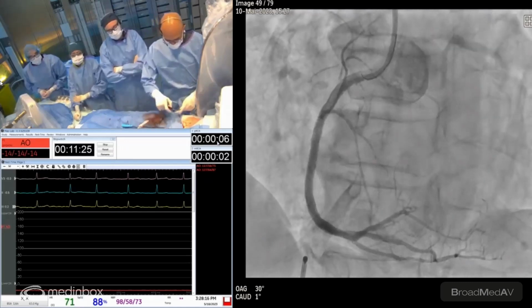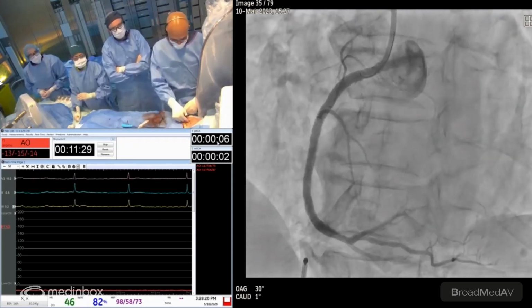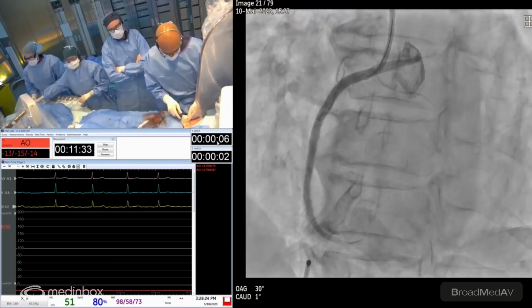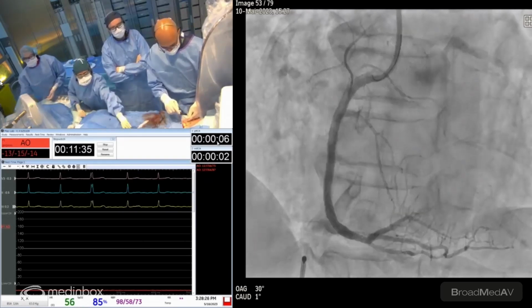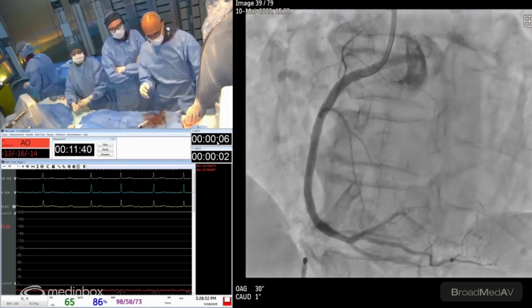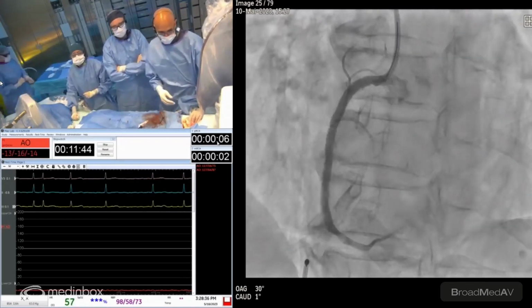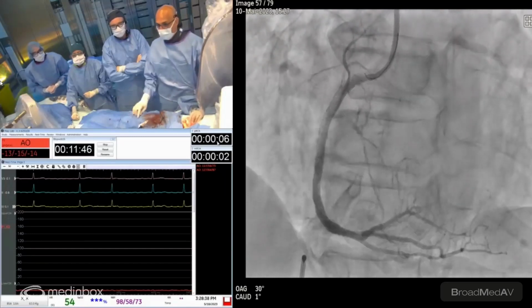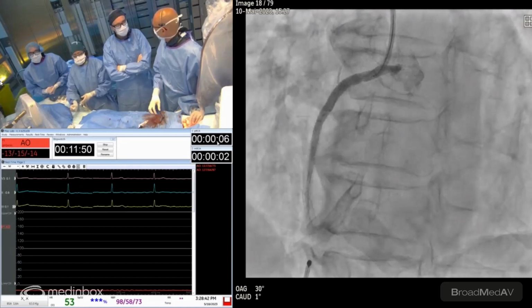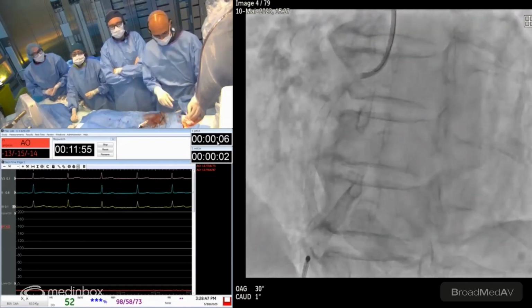But when the 3.0 balloon ruptured, it could have been an argument for a possible calcific nodule. Right. And calcific nodules are notorious for perforation. And in that case, if you've used rotational atherectomy and you didn't get deep enough in the calcific nodule, then using IVL would be very useful. Yep. And all this is to say that using imaging here really helped us guide the therapy and tailor it. When we saw those fractures post-rotablator, we knew that we could balloon at that point.